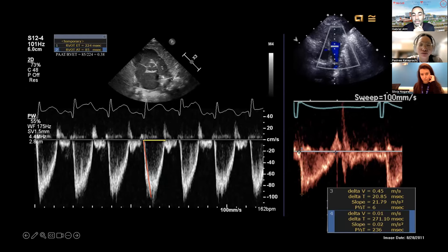Yeah. So the literature is a bit controversial on that. There are different papers looking at this, where for the cardiac output you get your Doppler at the RVOT, and then some centers and some papers have measured the acceleration time and RV ejection time in the pulmonary artery. That's an example of why we've done it here in the pulmonary artery, because it is called pulmonary arterial acceleration time. But I'll be honest with you, many centers do it on the same Doppler envelope.